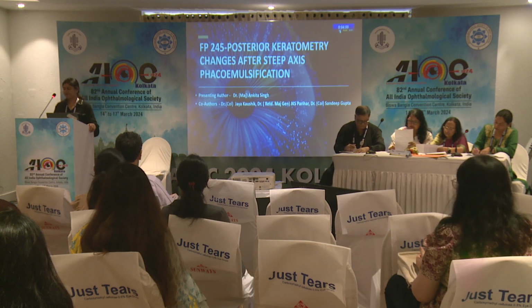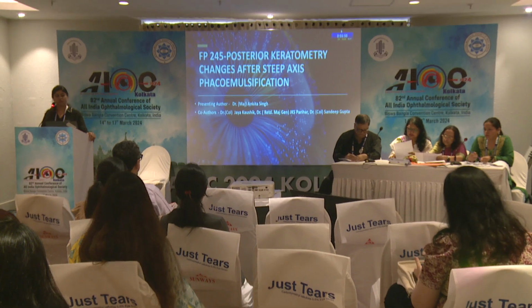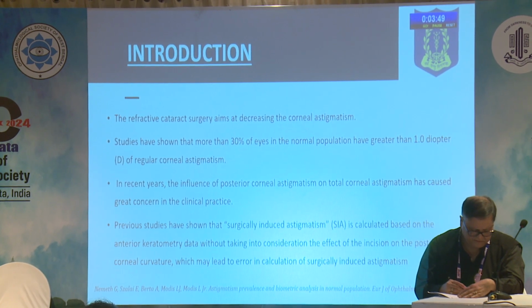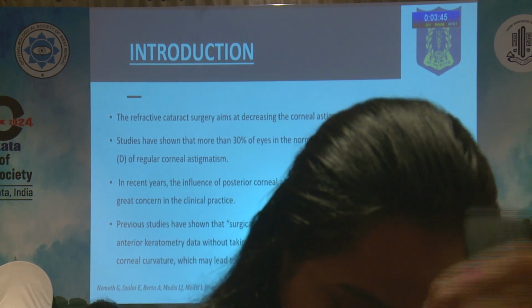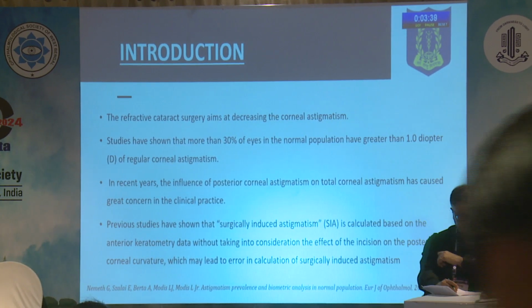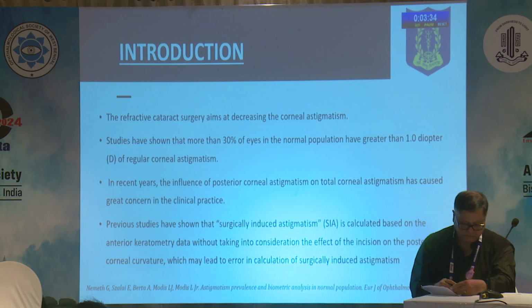Good morning, everyone. My topic is on posterior keratometry changes after steep axis phacoemulsification. Presently, it is a generation of refractive cataract surgery where everybody wants emmetropia. In our study, we have tried to find out the influence of the posterior corneal astigmatism on total corneal astigmatism, because so far, due to the primitive devices which existed earlier, only the effect of anterior keratometry was taken into consideration while calculating the surgically induced astigmatism.